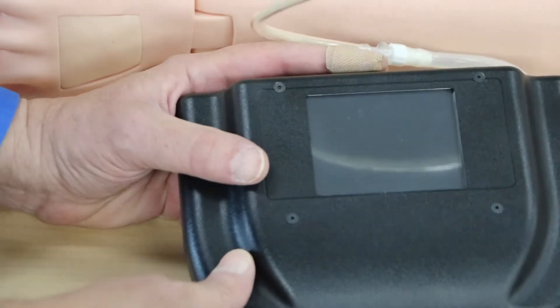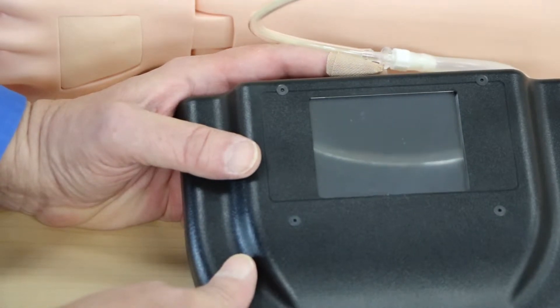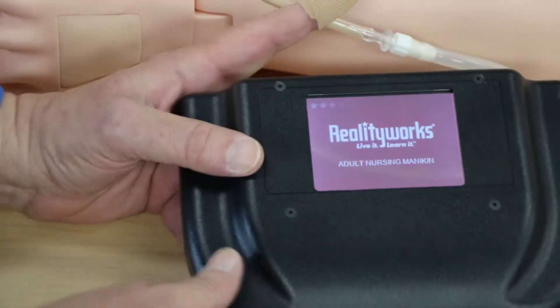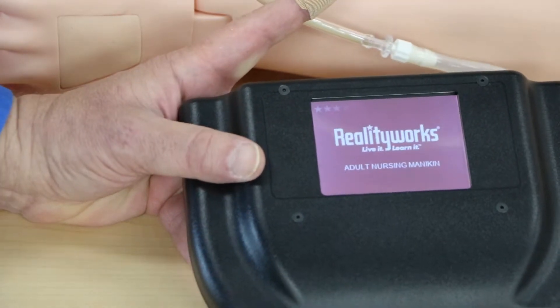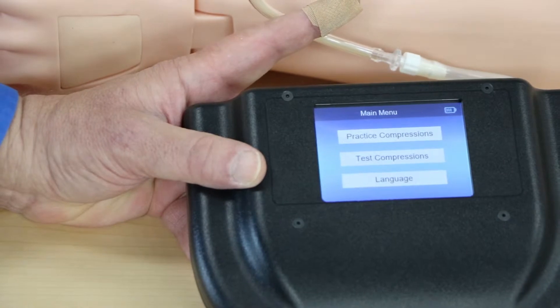I'm going to demonstrate how to do the student menu as well as the practice and test compressions. We turn the unit on the back by turning it to the one position, or on. It's going to boot up here and we are now on the student main menu, or main menu.